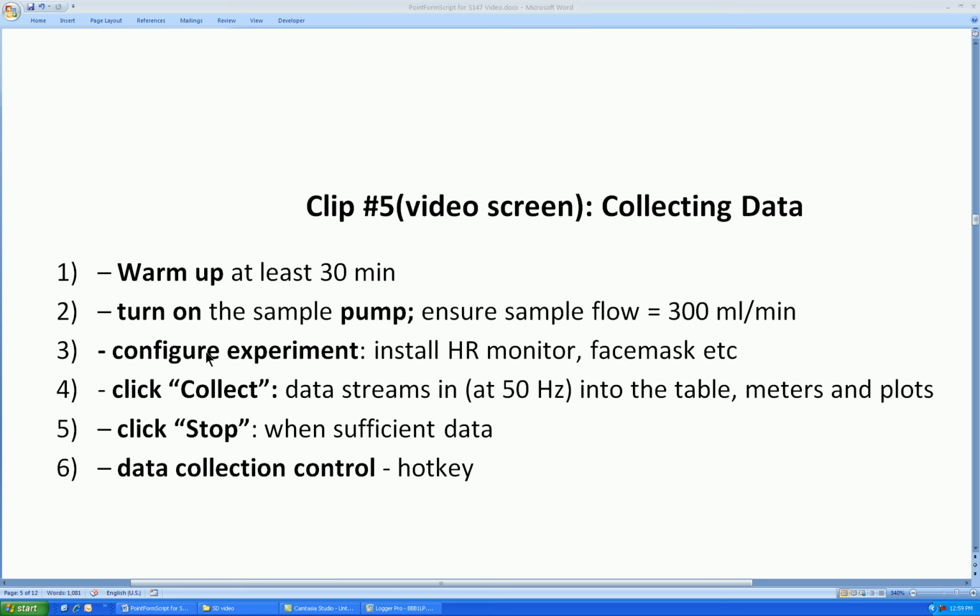Next, configure the subject for the experiment. In other words, install the heart rate monitor, ensuring that the receiver is within 1 meter of the transmitter. Put on the face mask, etc. Now I'm going to actually collect some breath data from myself, so I'll switch over to the empty template.